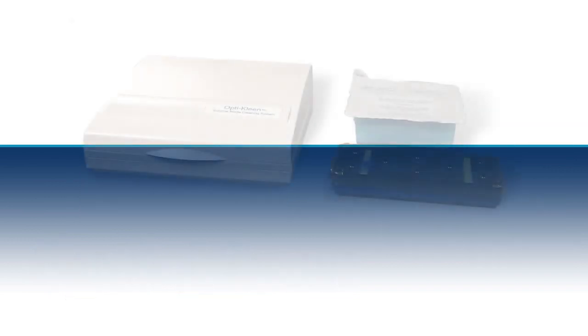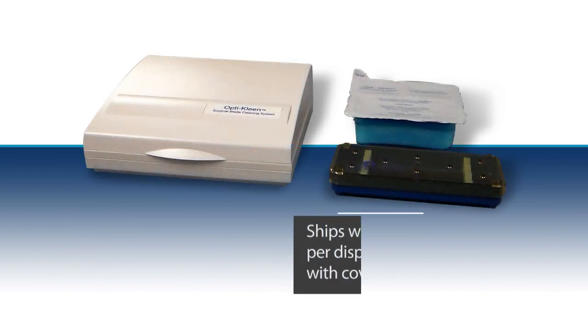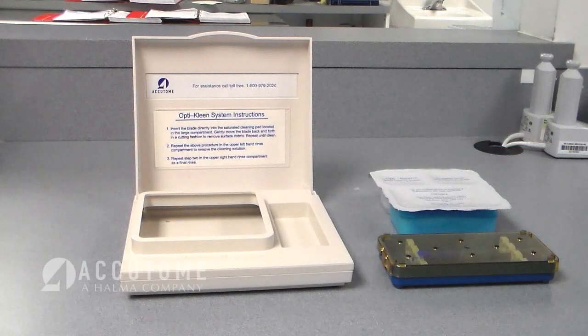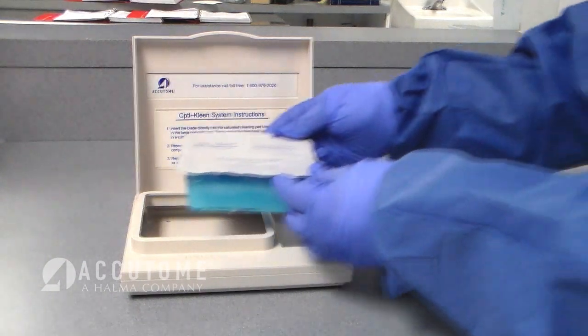The OptiClean blade cleaning system comes with 12 individual disposable trays per dispenser box. A holding tray with cover can also be purchased to cradle the cleaning system trays. The first step in the process is to place the OptiClean blade cleaning system into the holding tray.